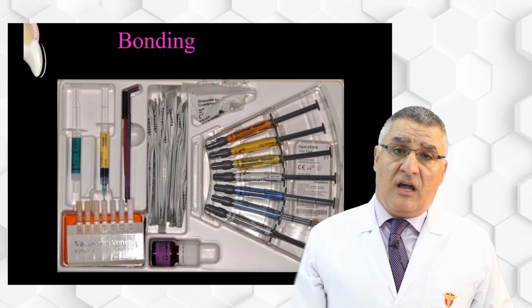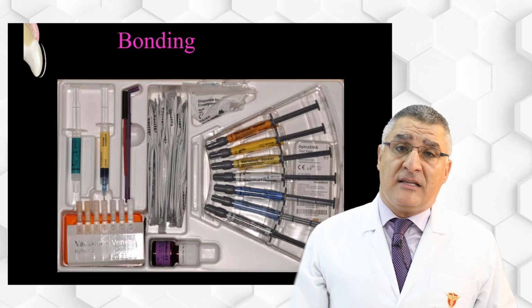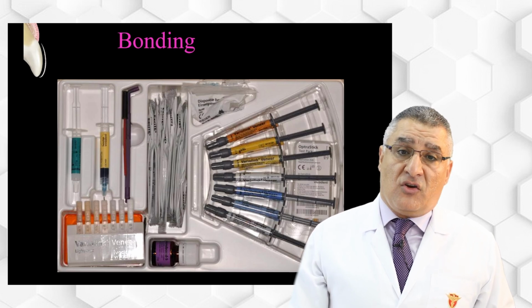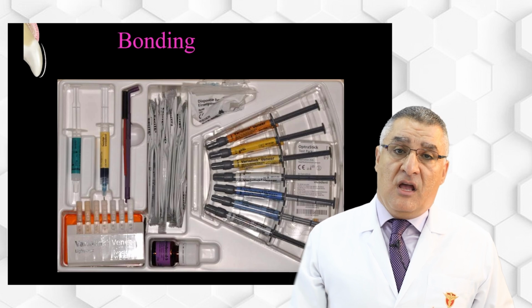The try-in shades have two functions. First, to hold all the veneers in place and let the patient check in a mirror the form, the shape, and the color of the veneers. The second is to select the suitable shade of the resin cement before you start to bond, because once you bond, you cannot remove the veneer again. So the try-in paste gives you the benefit of checking the form, shape, and color for the patients, and also what shade you should select for bonding of the veneer.